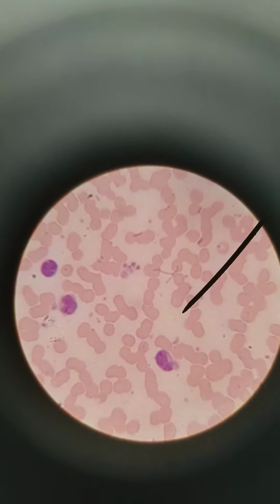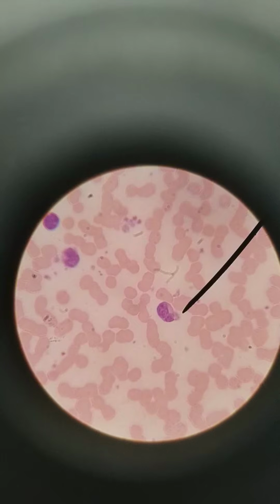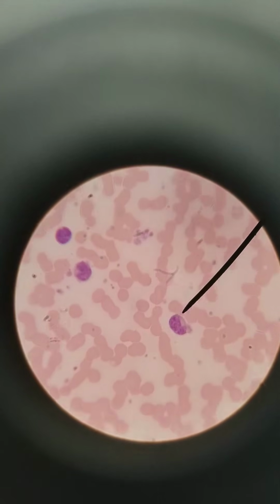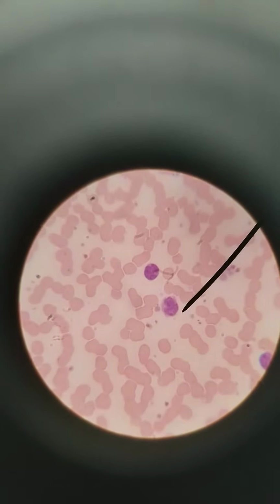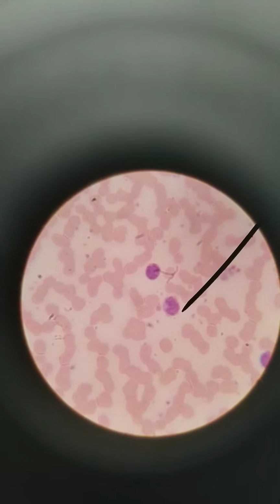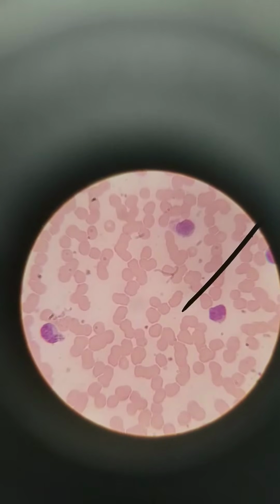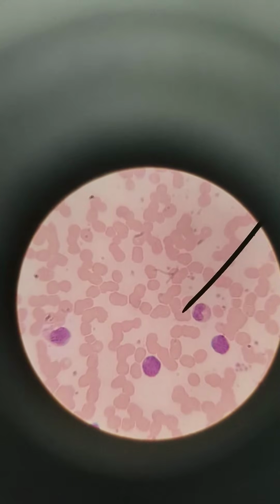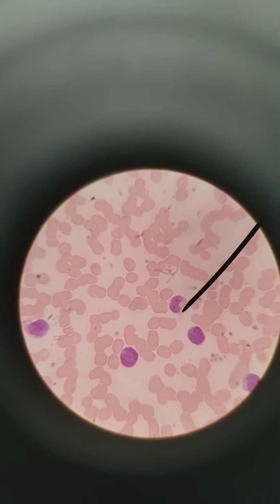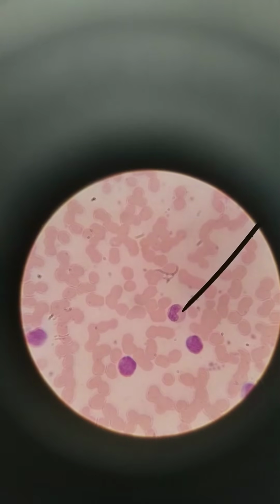Here, the cells that we see have a large kidney-shaped nucleus. Large kidney-shaped nucleus. These are monocytes. This is monocytic leukemia: large kidney-shaped nucleus, more monocytes than normal. Again, we're at 1000x total.